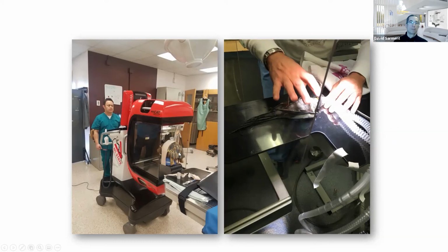And if you have exotics in your building, they will appreciate the flexibility of using the cone beam CT for their patients as well, because they'll typically be able to see anatomy in a way that they don't have access to in general, and in a relatively easy approach.